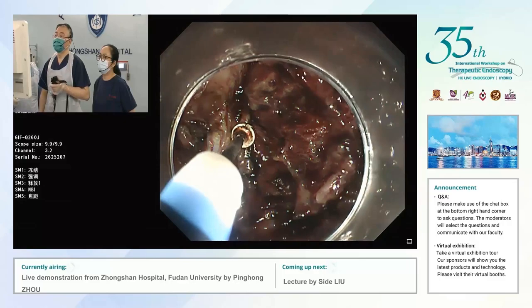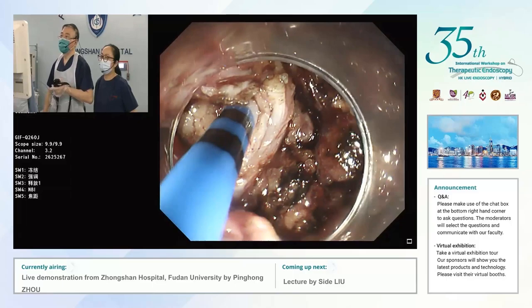For the endoscopy section of the submucosal area, we must remember: never cut into the tumor. Maybe this is the last cut for this lesion.